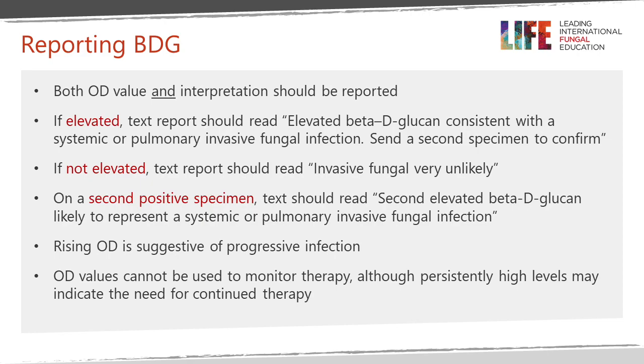If the BDG result is elevated, then the text report should read, if you have enough space in your reporting system to provide it, elevated BDG consistent with a systemic or pulmonary invasive fungal infection. Send a second specimen to confirm. If the BDG is not elevated, the text report should read invasive fungal infection very unlikely. It doesn't absolutely exclude it, as I will show you.